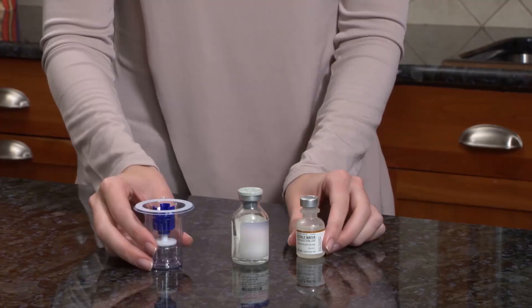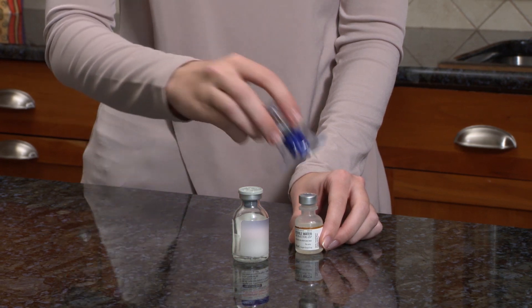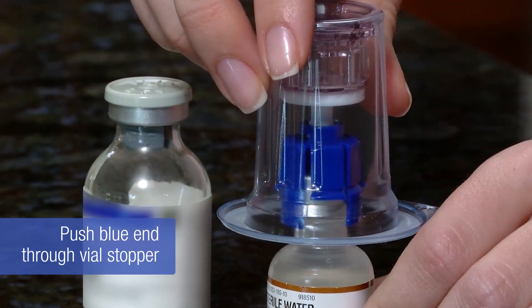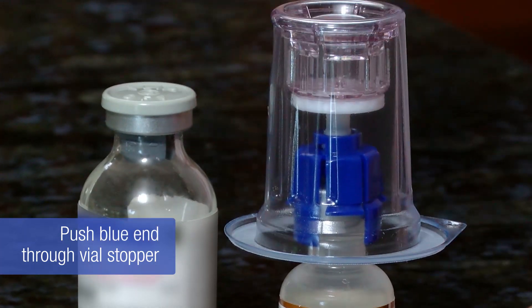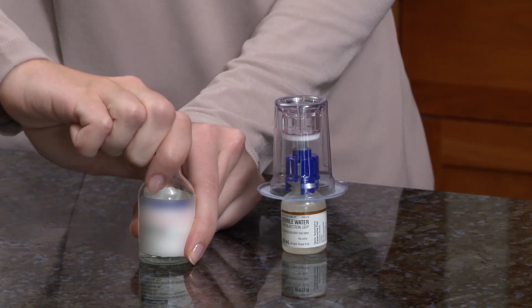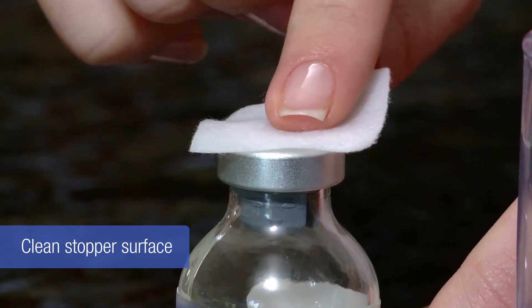Place the water vial upright on a firm flat surface. Pick up the mix-to-vial device by the packaging and push the blue end down through the water vial stopper. Do not remove the packaging at this time. Remove the flip-off cap from the product vial and clean the stopper surface with an alcohol swab.